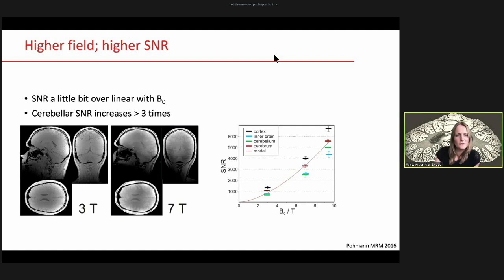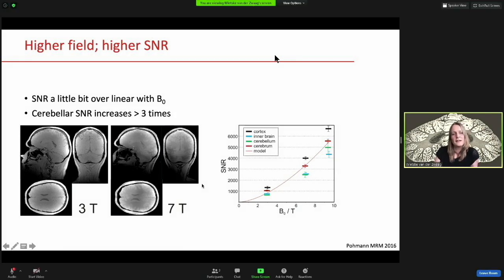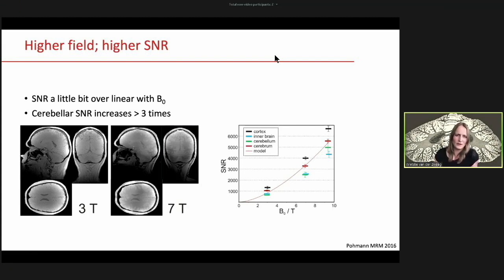It's T1 weighted, I believe. And there's this gross sort of shading over the brain. There's a dark shadow here and reaching up here. And these are the B1 inhomogeneities, or the effects of the B1 inhomogeneities that I mentioned earlier.